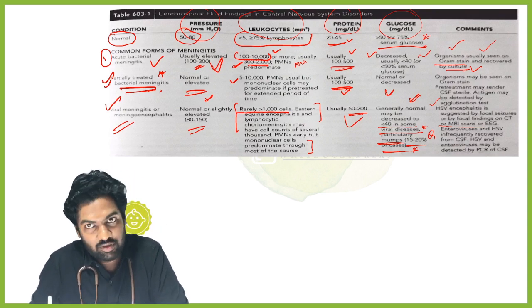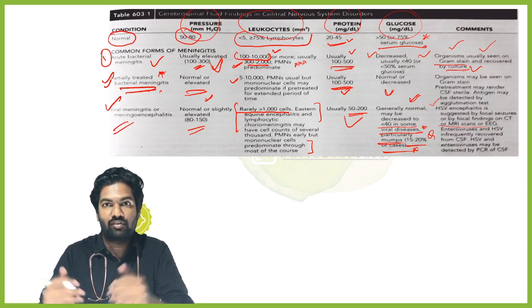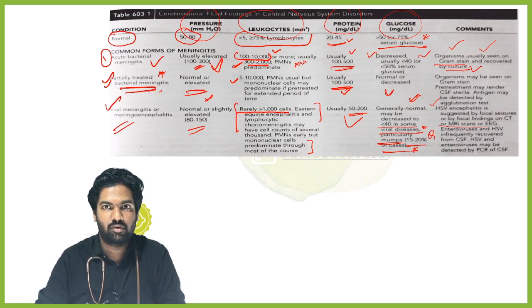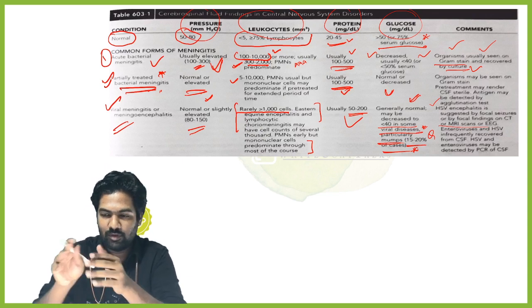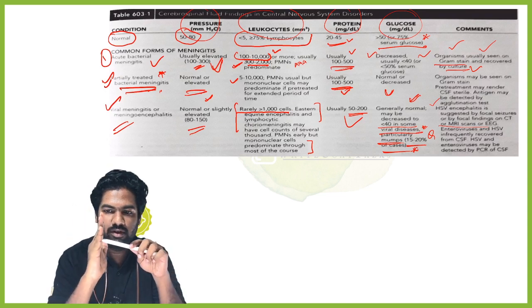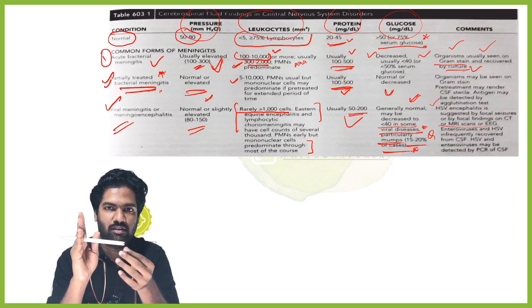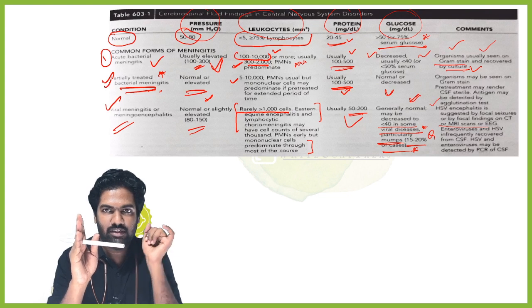For that you have to know the procedure. We are discussing instruments here, not the entire procedure. I want you to go through the procedure properly, because the moment you do the LP, imagine this is the back. The moment I try to enter, I'll feel a giveaway. Then I'll remove the stylet, and the CSF will start dripping.